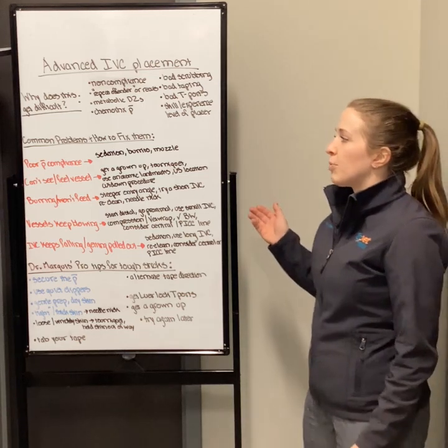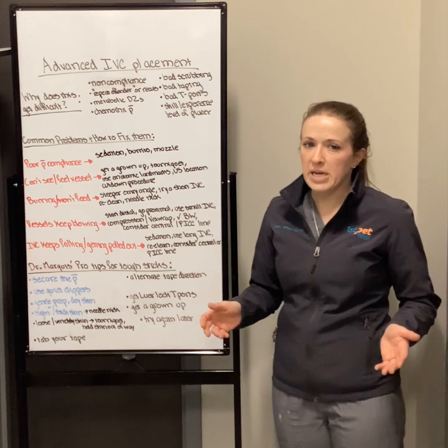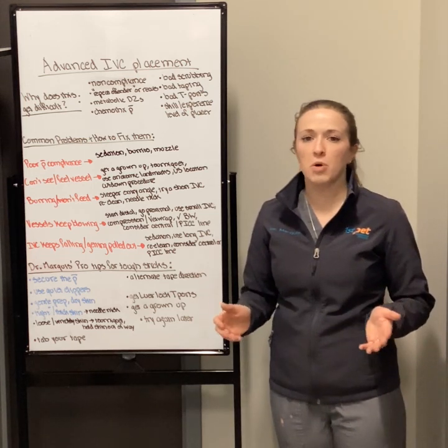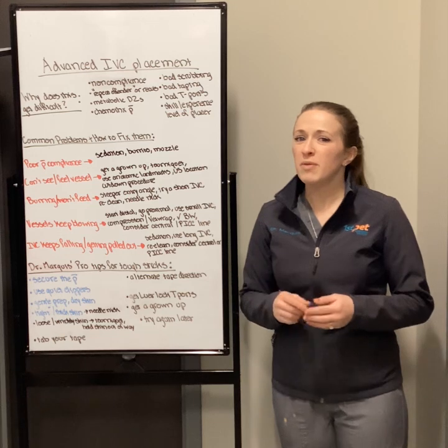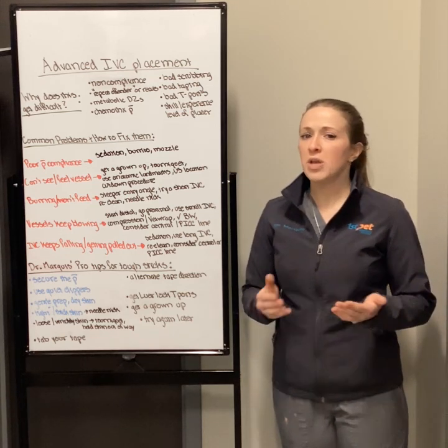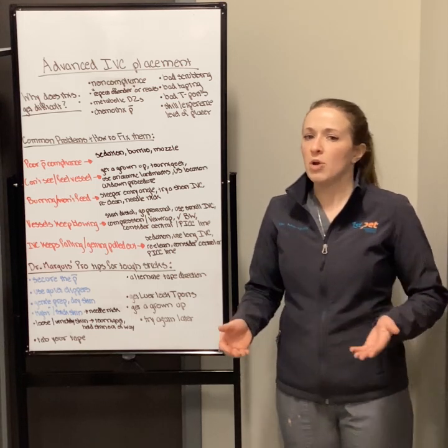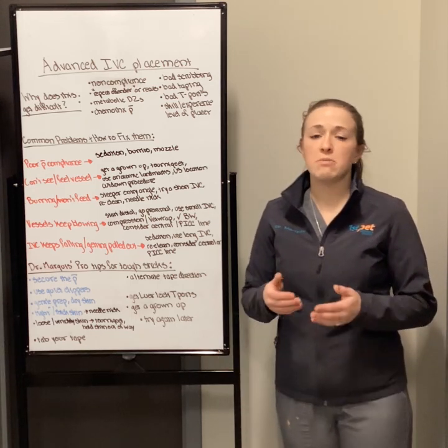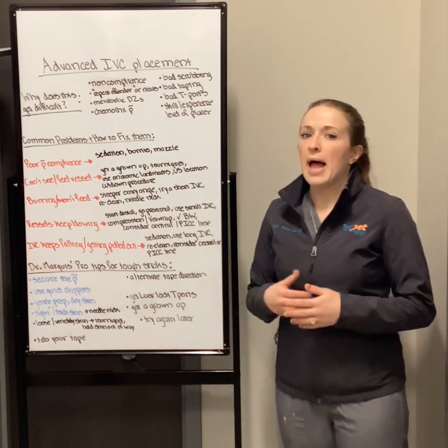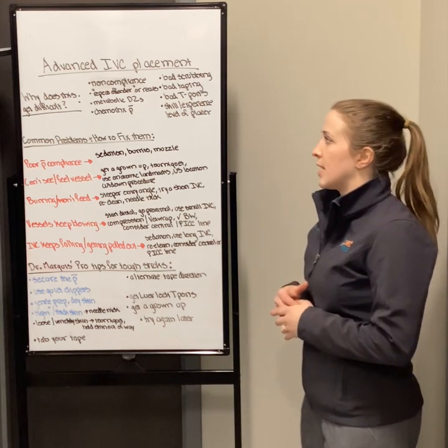So let's talk about a couple of reasons why catheter placement can be kind of challenging. There are many. I think one of the most obvious ones is a patient that is just having none of it, so non-compliance. If you have a very fearful, painful, aggressive patient, it's going to be difficult to handle them, and if they're not still, relaxed and cooperative, you're not going to be able to find your vessel. It doesn't matter how good you are at placing catheters, it doesn't matter how quick you are. If the patient is not going to be cooperative, that's going to be kind of the end of that story.